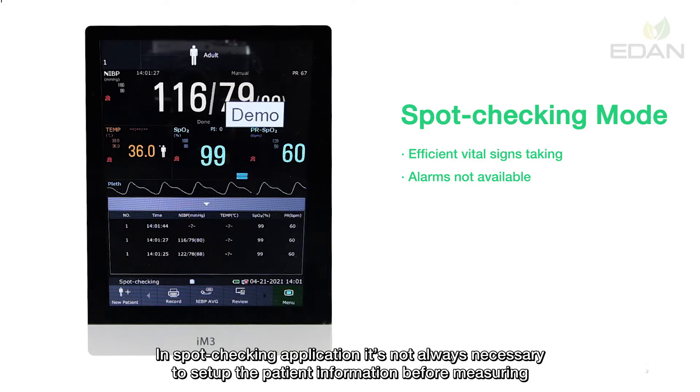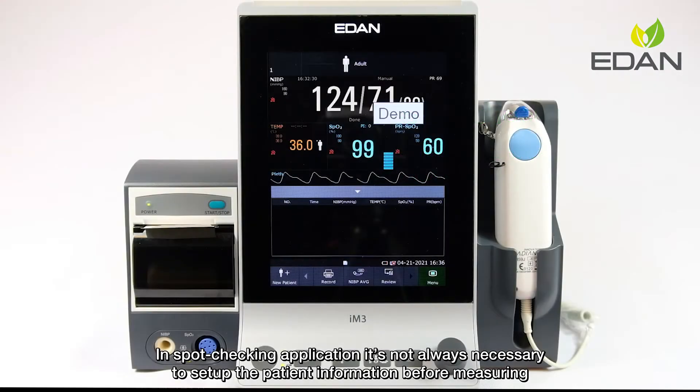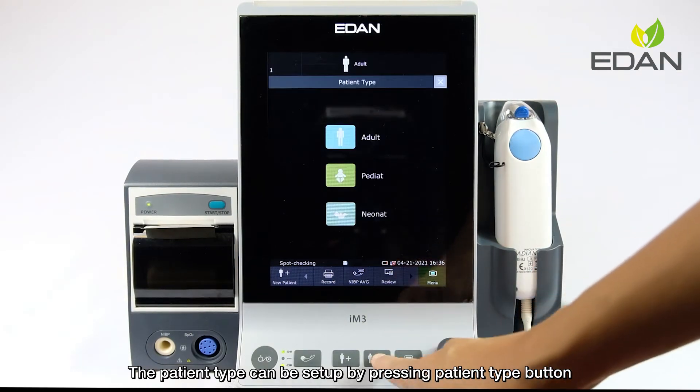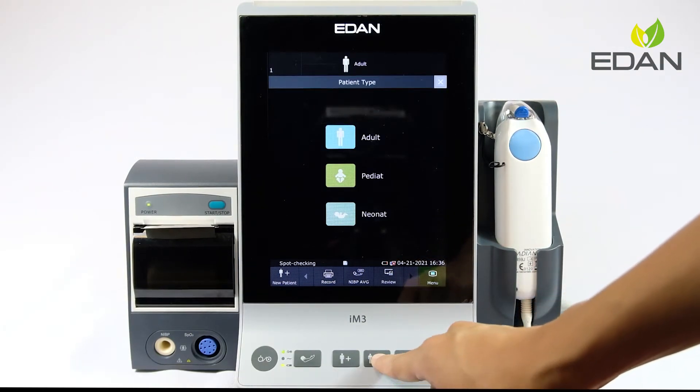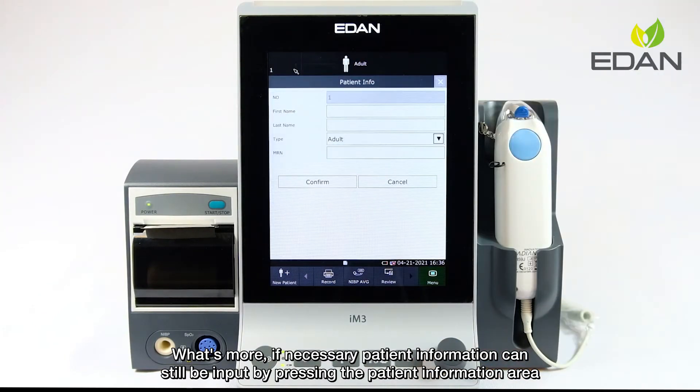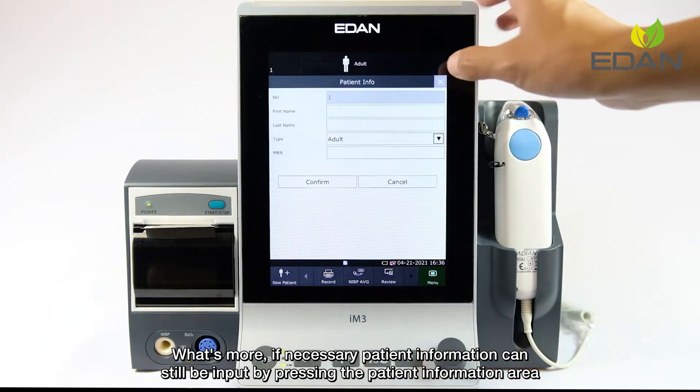In the spot-checking application, it is not always necessary to set up the patient information before measuring. The patient type can be set up by pressing the patient type button. If necessary, patient information can still be input by pressing the patient information area.